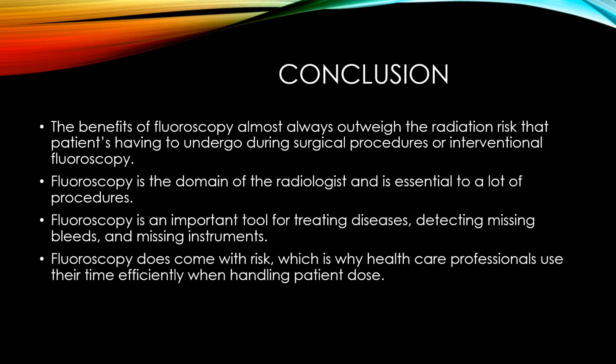The benefits of fluoroscopy almost always outweigh the radiation risk that patients have to undergo during surgical procedures or interventional fluoroscopy. Fluoroscopy is the domain of the radiologist and is essential to a lot of procedures. Fluoroscopy is an important tool for treating diseases, detecting missing bleeds, and missing instruments. Fluoroscopy does come with risk, which is why healthcare professionals use their time efficiently when handling patient dose.